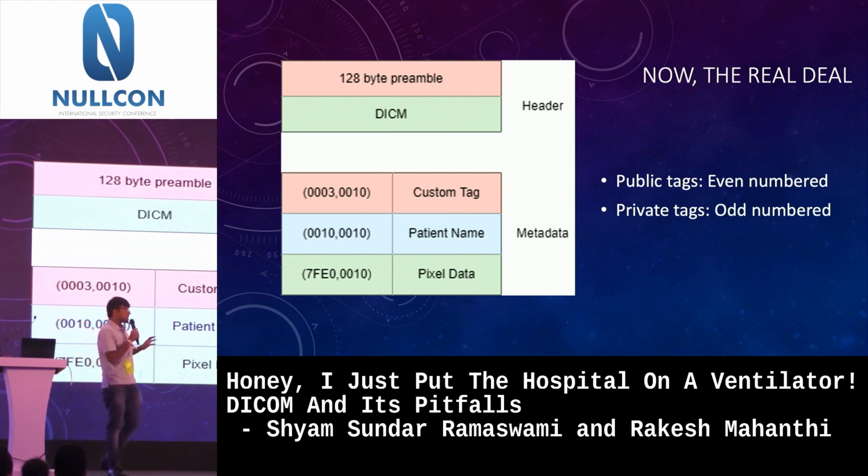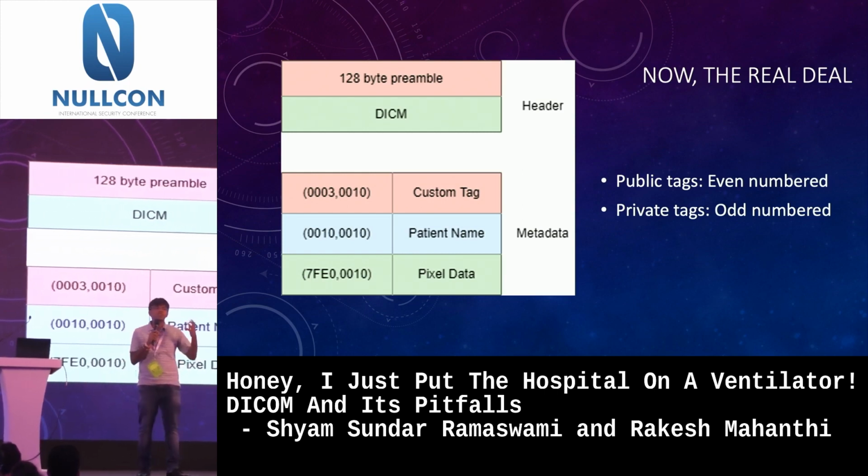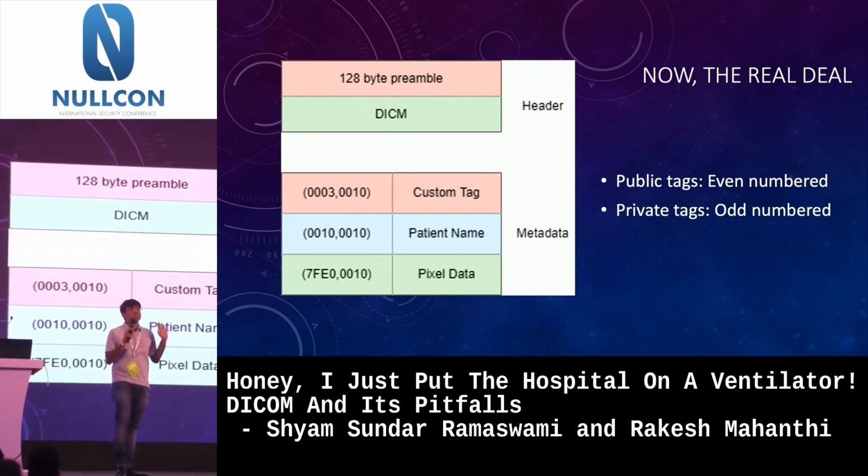But there is another set of tags called private tags. These private tags were provided in order to give the hospitals freedom to add their own custom tags.